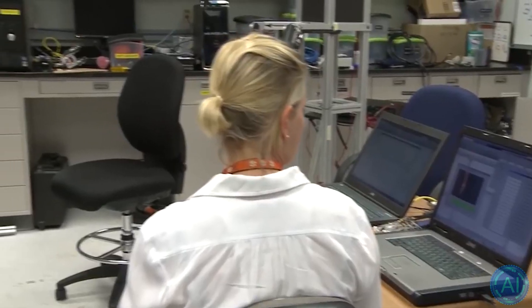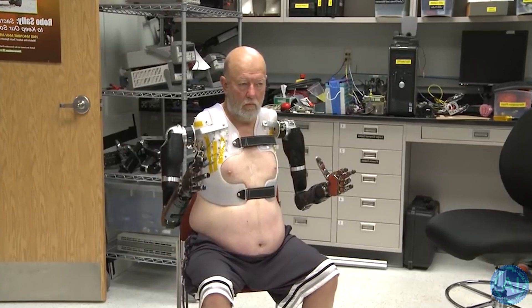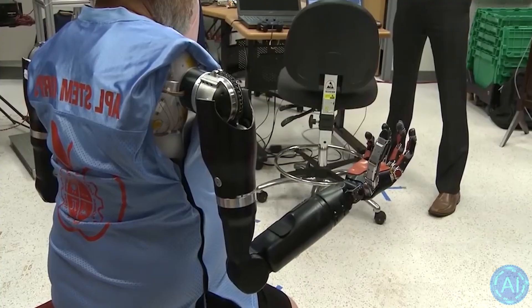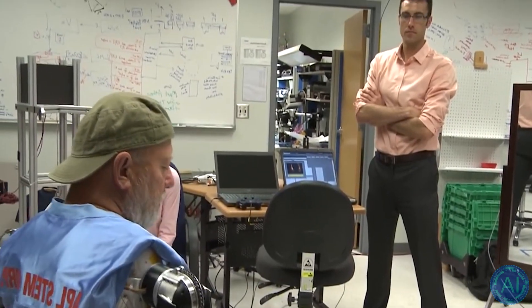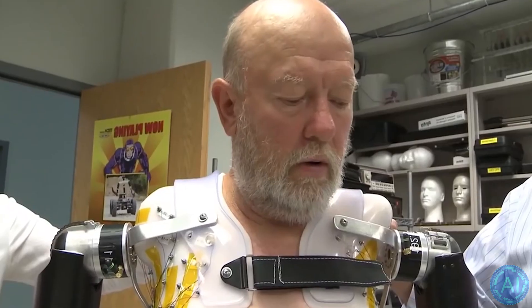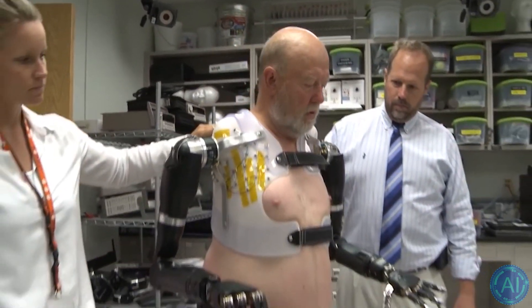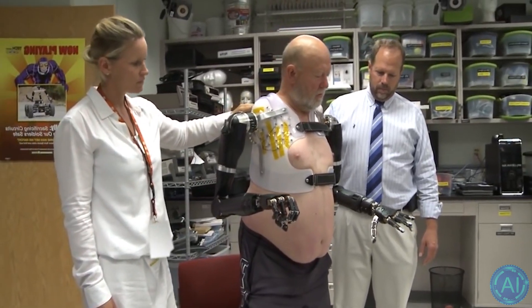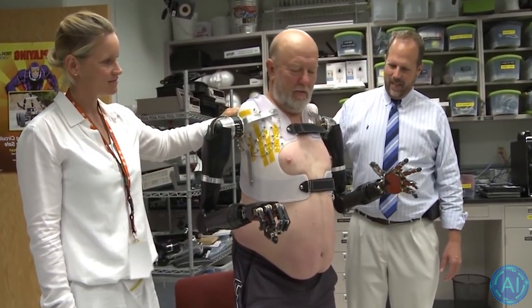First, APL started work on their prosthetics by working on their pattern recognition systems which work similar to machine learning. This pattern recognition system looks at electrical signals that come from the brain into the user's chest muscles to appropriately move the user's arms. The training and practice was actually done in a virtual reality system where the amputee controlled a virtual arm instead of going right to a real robot arm.